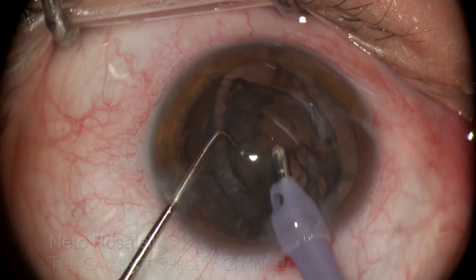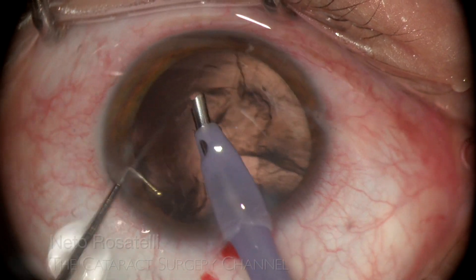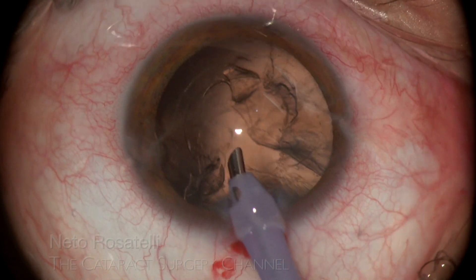Notice that I keep the phaco tip completely still in the safe zone, while the chopper is in posterior capsule protective mode, preventing it from coming to the tip.